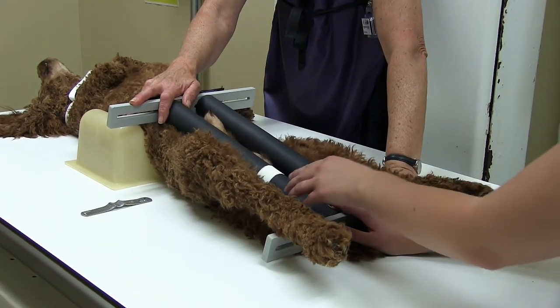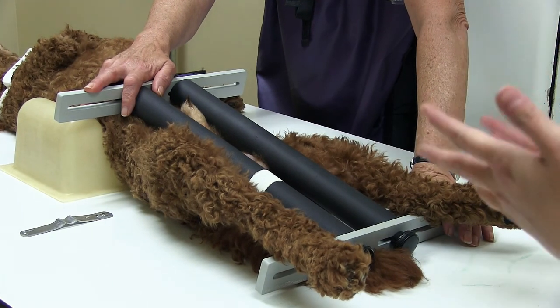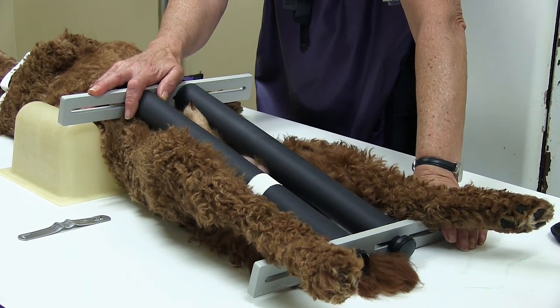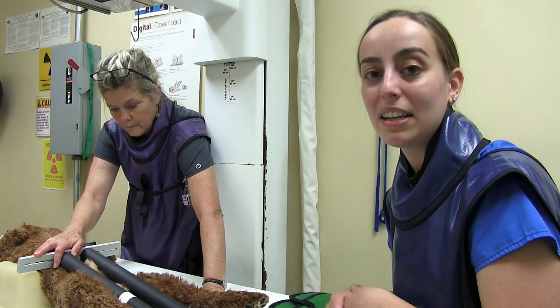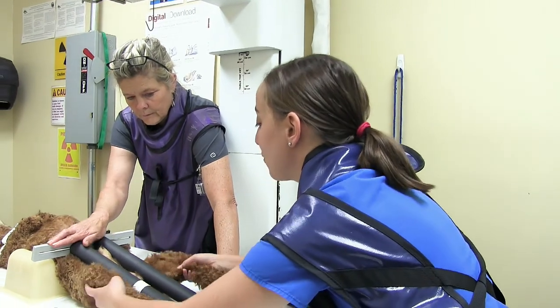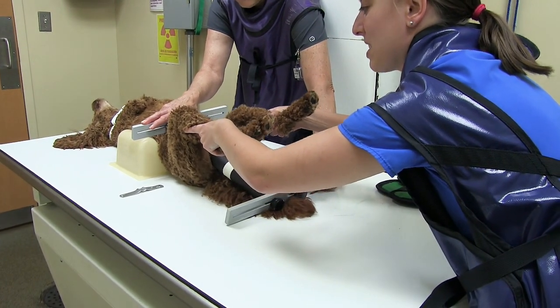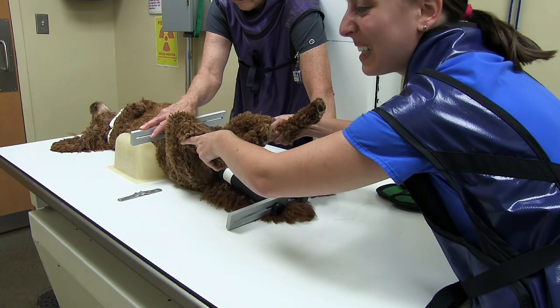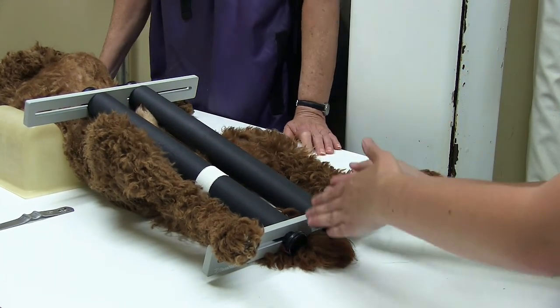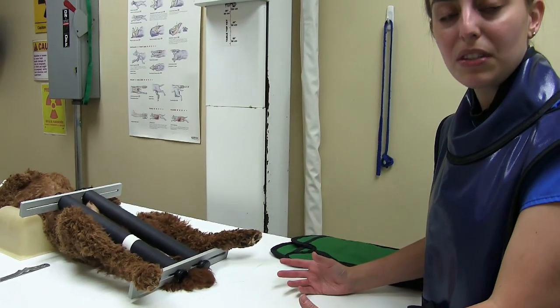This dog is small, so it's pretty narrow. The purpose of this tool is to put some outward pressure on the hips — we're not trying to move the hips out of the socket, just to put a little bit of pressure and see the extent of laxity. PennHIP gives you a number to quantify the degree of laxity. We put the distractor over the hips and apply some pressure, then compare that to the second shot to see how the hips look normally versus when there's a little bit of extra pressure.